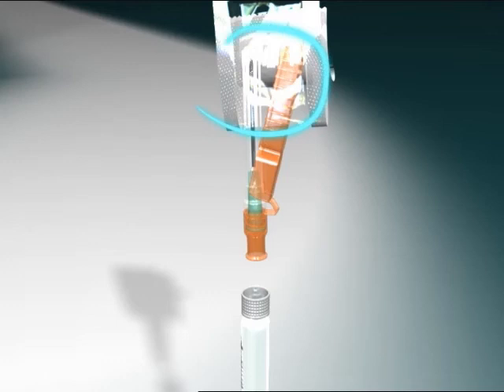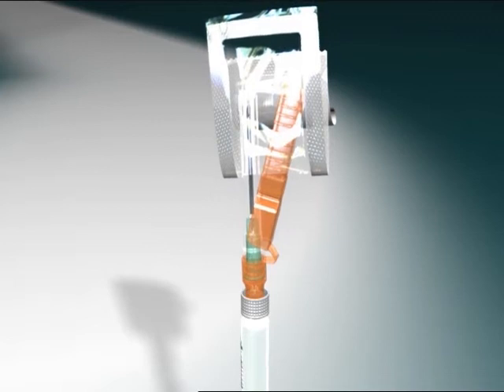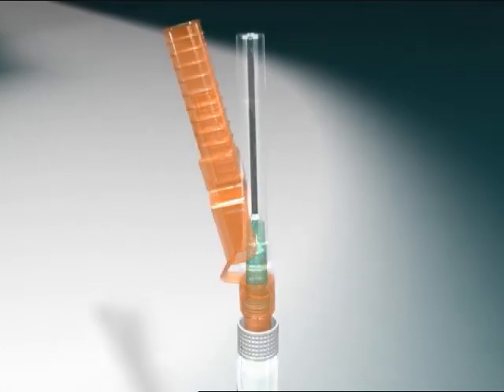Grasp the transparent needle sheath using the plastic peel pouch. To prevent contamination, be careful not to touch the Orange NeedlePro safety device's lure connector. While holding the white collar on the syringe, attach the lure connection of the Orange NeedlePro safety device to the syringe with an easy clockwise twisting motion. Then grasp the transparent needle sheath and seat the needle firmly on the Orange NeedlePro safety device with a push and a clockwise twist.